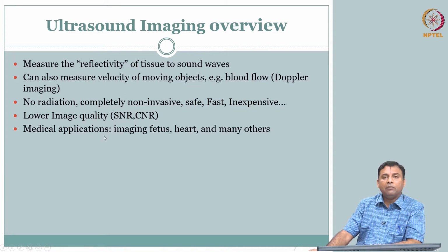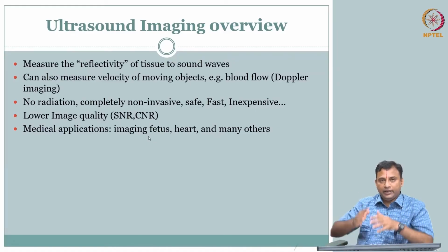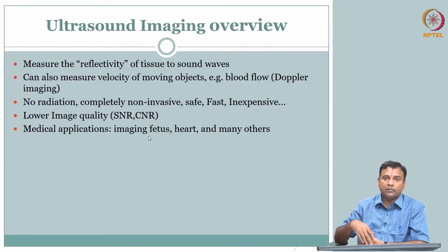However, there are some medical imaging applications for ultrasound that are unparalleled. For example, imaging the fetus, right. The baby inside the tummy, you are not going to give radiation, all of that is risky. Maybe MRI also, we did not cover it, but we have seen the photo of an MRI in our intro. You see the patient on the table, or maybe you have seen it in person at some imaging center. You have to go into that big tunnel, like your CT, so that may not be that comfortable for the mom. So, imaging the fetus is a very powerful application for ultrasound.